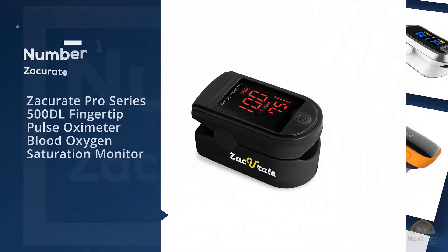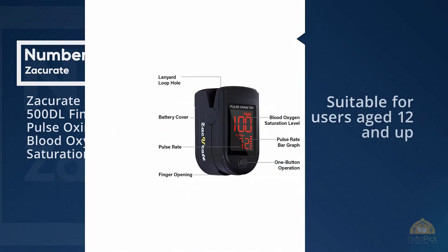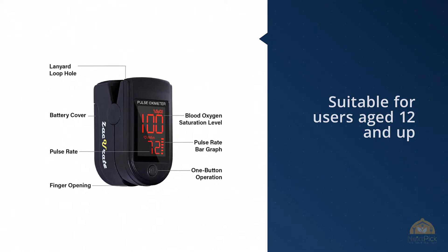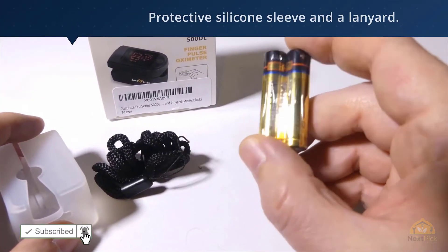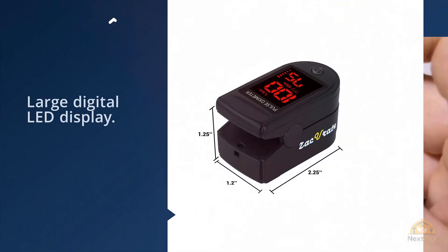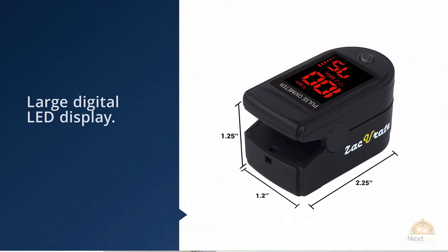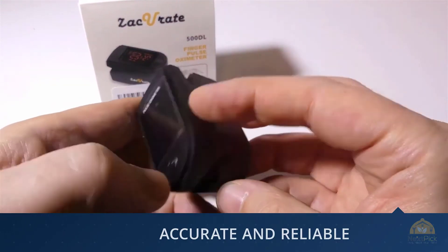Number 1: Most Popular — Zaccurid Pro Series 500DL Fingertip Pulse Oximeter Blood Oxygen Saturation Monitor. The recently upgraded Zaccurid Pro Series 500DL shows readings in bright red characters against a contrasting black background. It's suitable for users aged 12 and up and comes with a protective silicone sleeve and a lanyard. Accurately determine your SPO2, pulse rate, and pulse strength in 10 seconds, displayed on a large digital LED display.